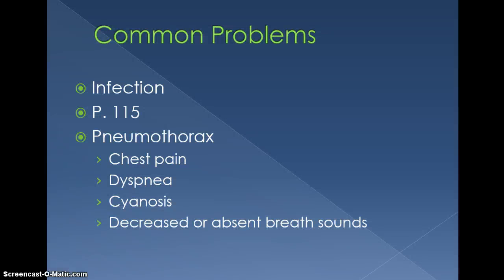Okay, there are common problems for any central venous therapy access device. Infection is first and foremost because it is an invasive procedure, so you should know the signs and symptoms of an infection by now. So we're not going to review those. Sometimes it's just a problem with the catheter itself.